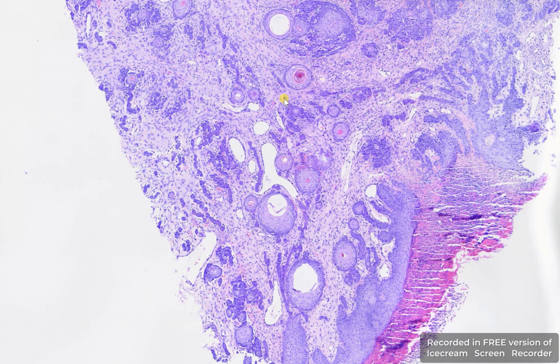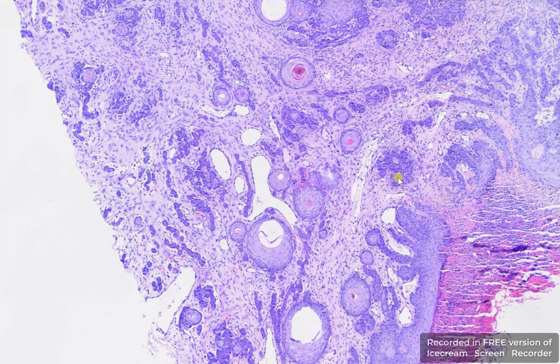These are biopsy samples from the oral cavity of a female poodle dog. There is no history of the age of this dog, and this sample was diagnosed as a squamous cell carcinoma. Here are a few characteristics of the squamous cell carcinoma of this dog.